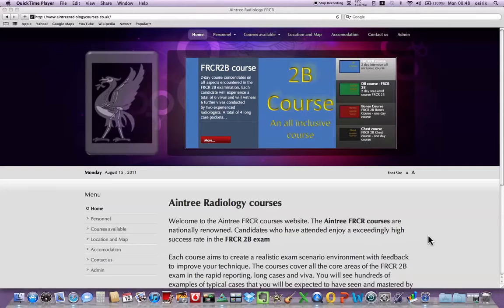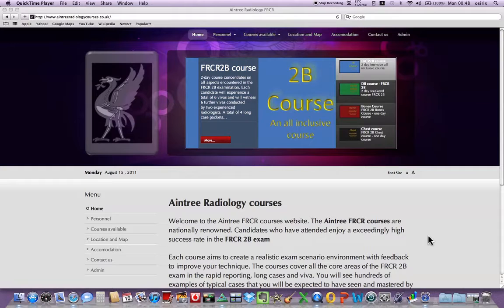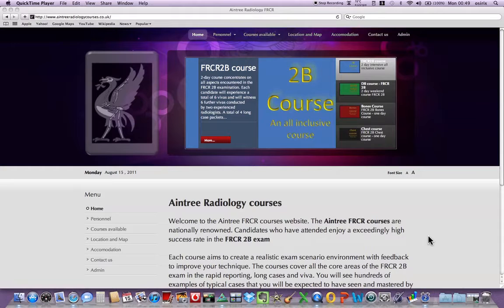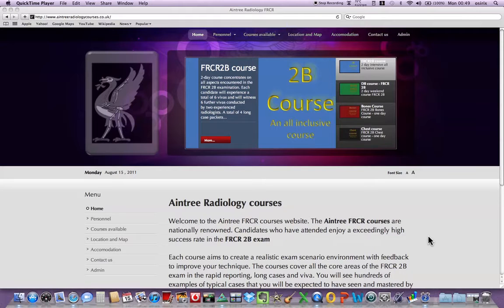Welcome to the Aintree Radiology FRCR course website and the online demonstration of OsiriX software. OsiriX is a free software which can be downloaded from the internet and is used in PACS systems and Mac platforms for teaching databases.